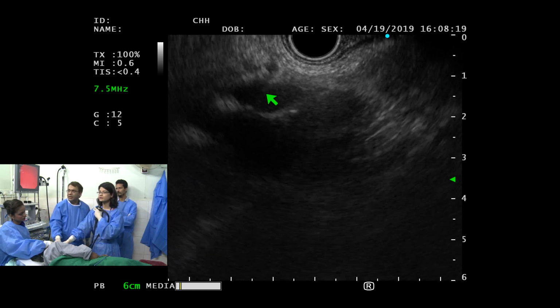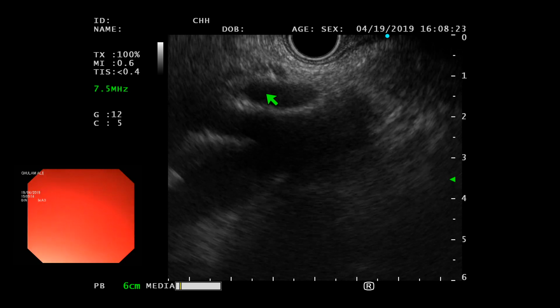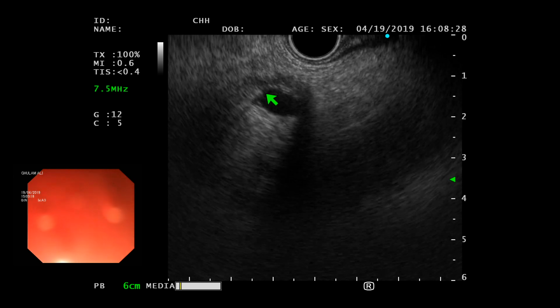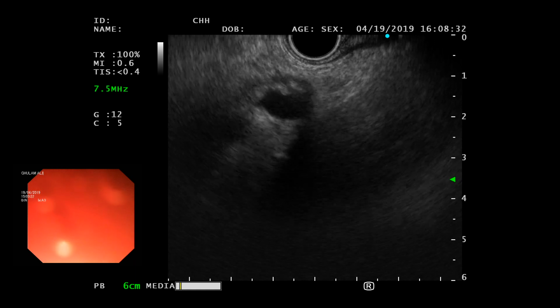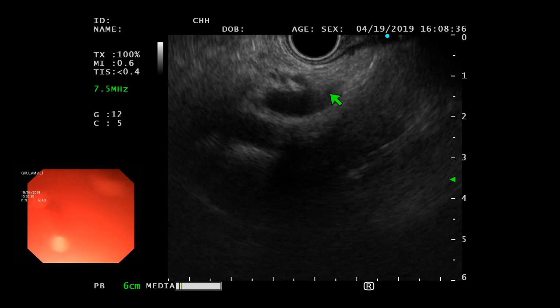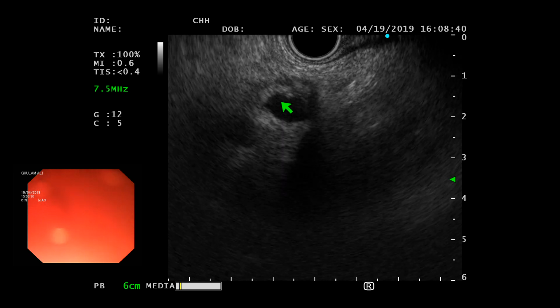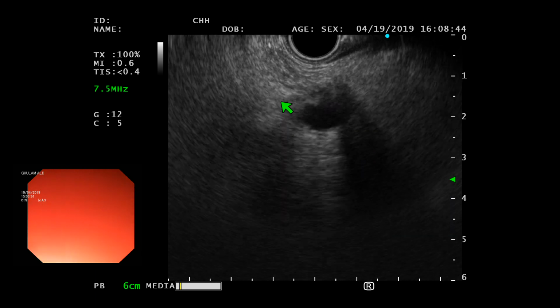Gently release the wheel a little bit, so that will take you to the gastric right there. So let's bring that back. Good. You see here, there's a branch coming off here. That's a left gastric, right there. We're gonna forget about that. We will just follow the main celiac trunk. Gently rotate a little bit to the left.